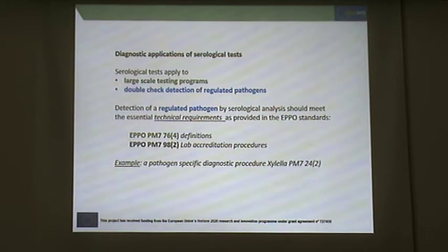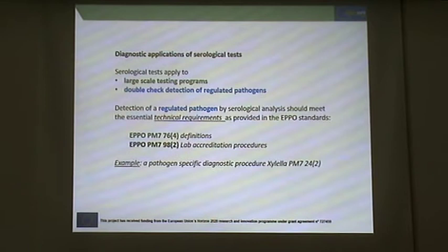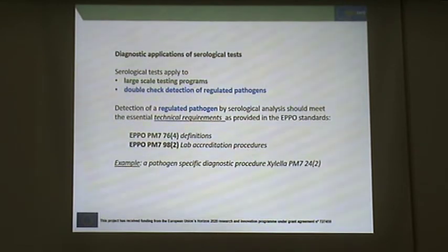When a diagnostic test is supposed to apply to a regulated pathogen, it has to meet some technical requirements. So I wanted to point out the EPPO standards number 76, fourth version, and 98, second version, where we can find the requirements to validate a serological test, well, not only, any diagnostic tool.